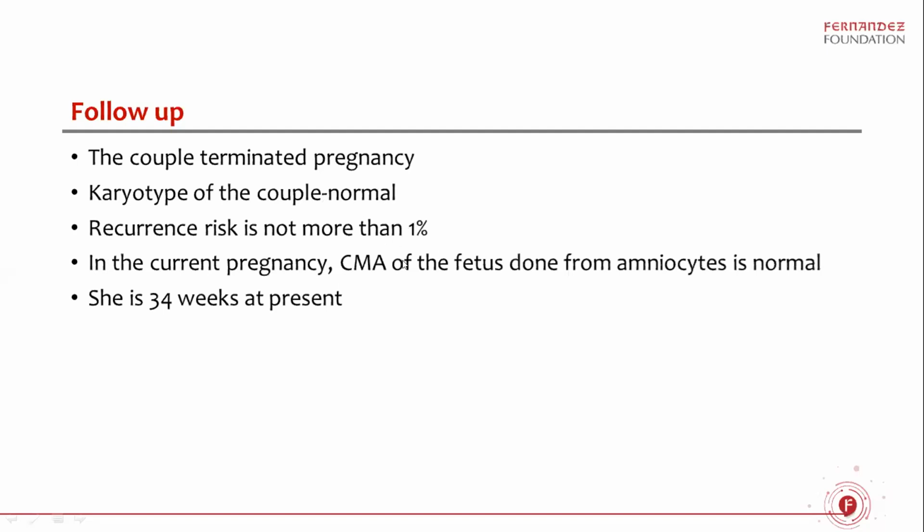In the present pregnancy, chromosomal microarray was opted by this couple from the amniocytes, and it was normal. She is 34 weeks at present. The IFA scan was normal, growth is normal at present, and the pregnancy is ongoing.